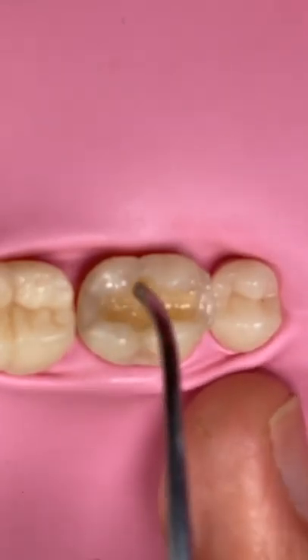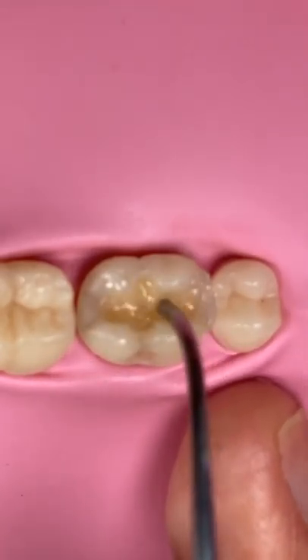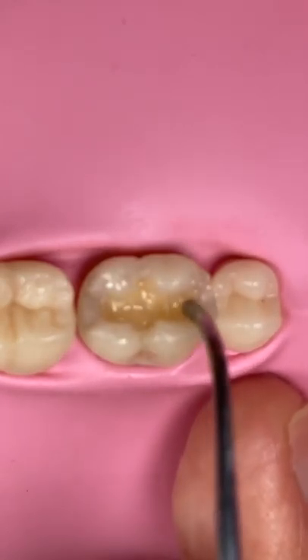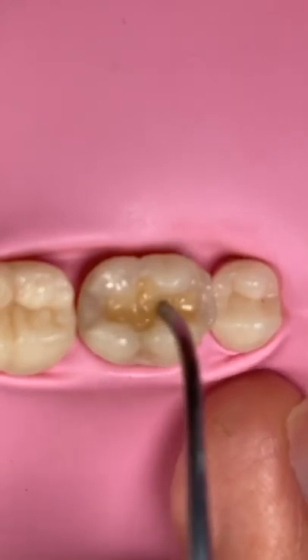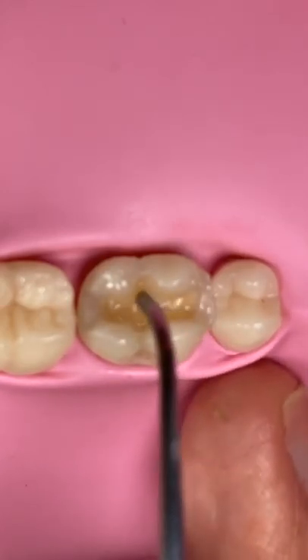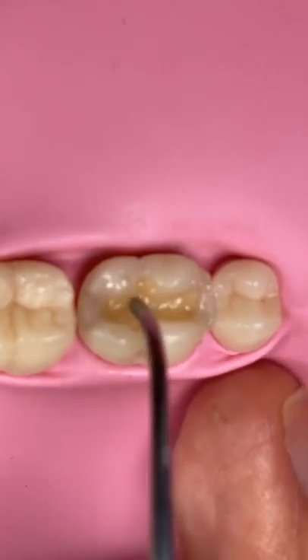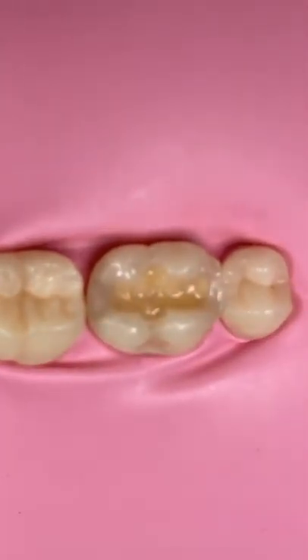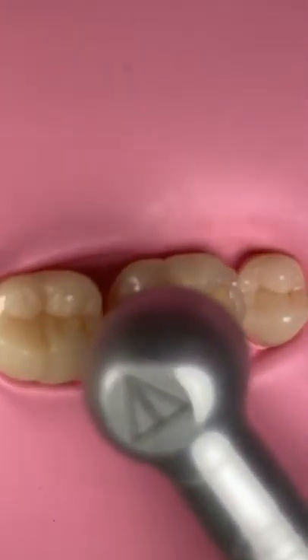Okay, how to choose dentin. Actually, I have a recipe for dentin: high chroma dentin and high value enamel. The yellowish dentin that you have in your clinic, let's say A2, A3, A4, you use A4, and for enamel, the highest value, you can use A1. So the idea is to cover all the dark area. High chroma means the yellowish dentin that you have. And then cure.